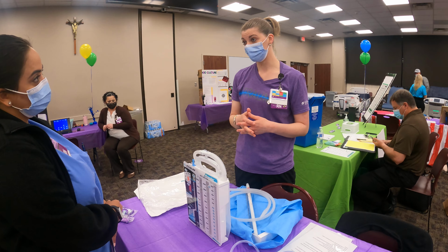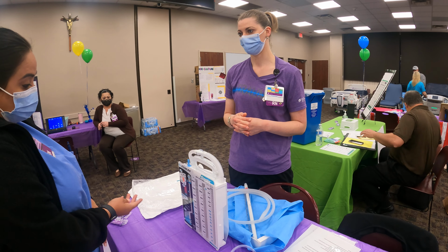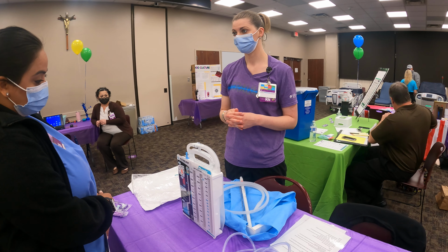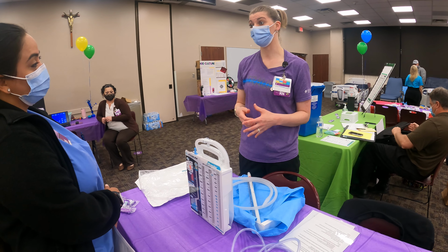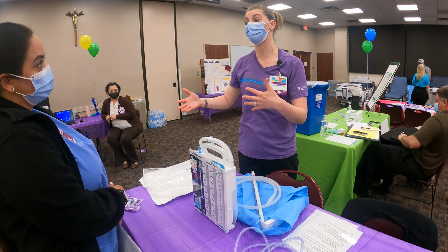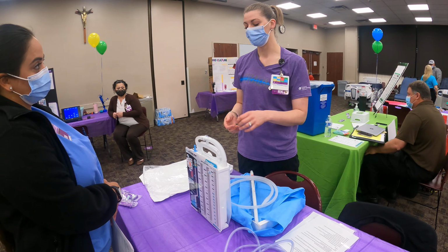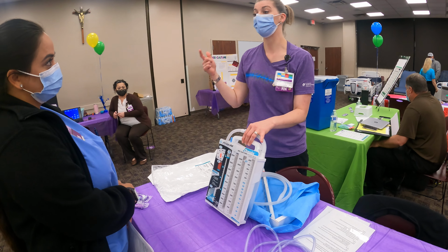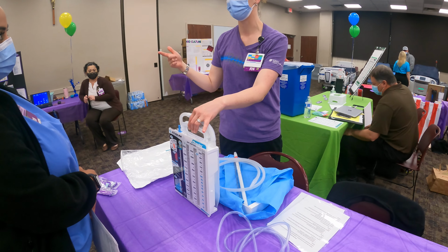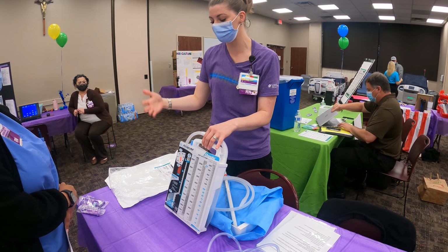How do you know if there is a leak in your chest tube? You'll see bubbling. Intermittent bubbling is totally normal. So we're taking those deep breaths, or the patient's moving around the room. You're going to see some intermittent bubbling, and that's fine. But if the bubbling doesn't ever stop, if it's constant bubbling, there's a leak, and it's going to keep on bubbling.